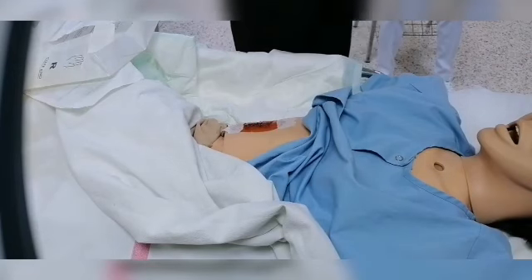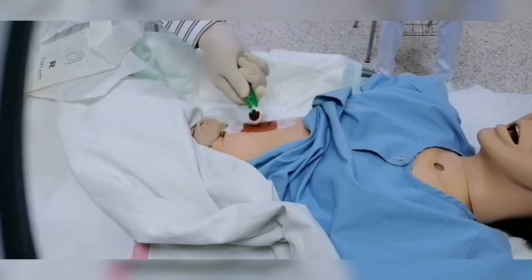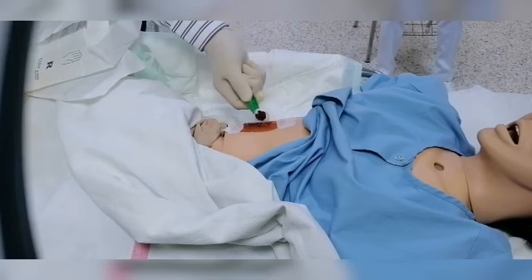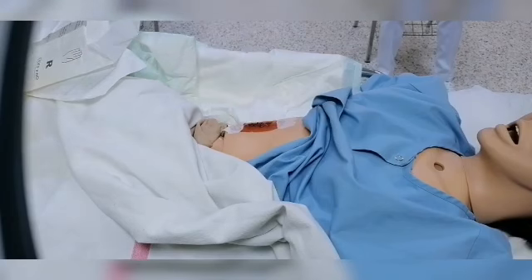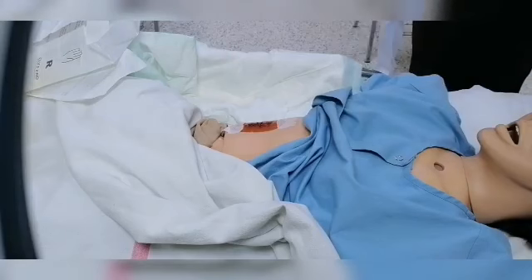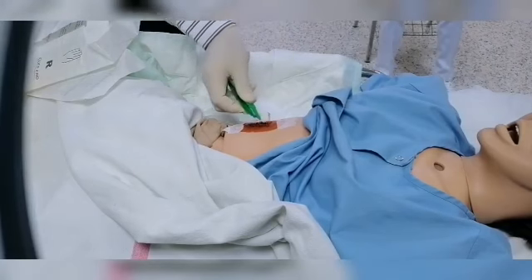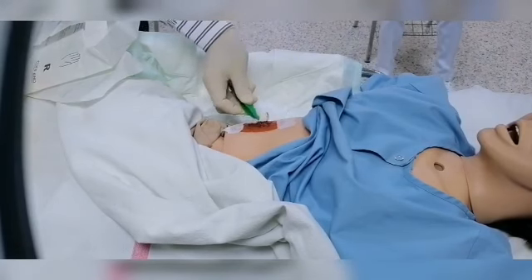I will continue with that, starting from the center of the wound toward the edges, until I finish. Then I have to clean with saline after that to avoid the irritation of the betadine.